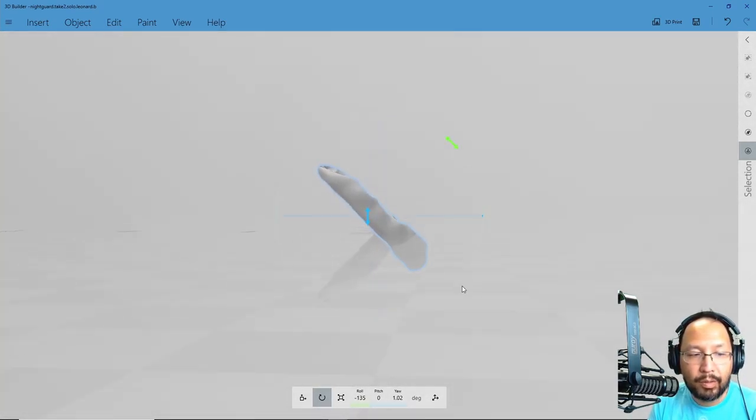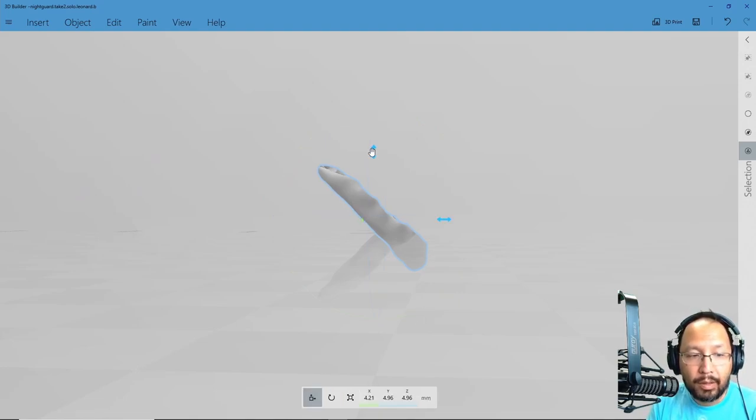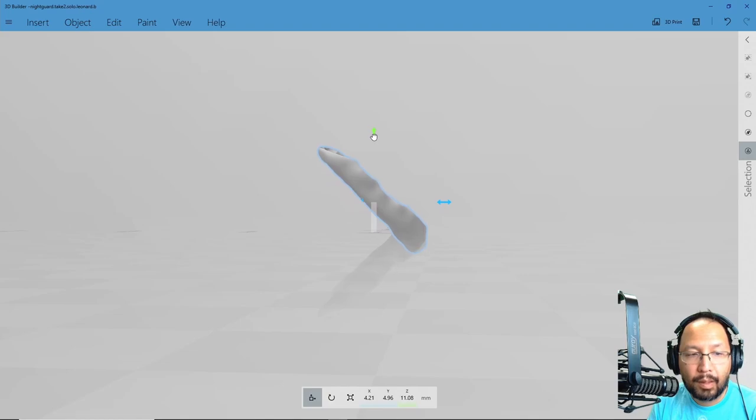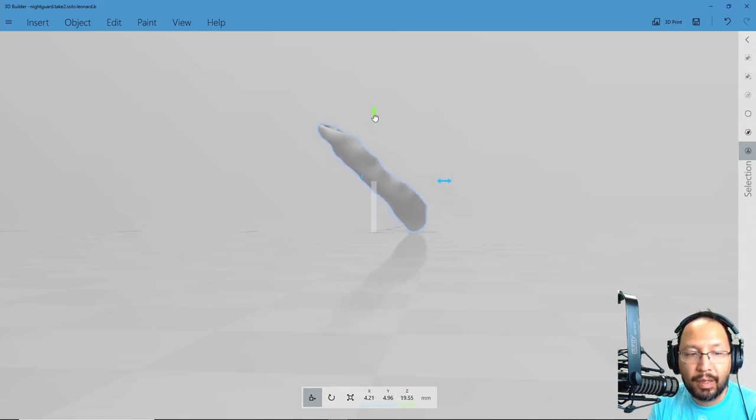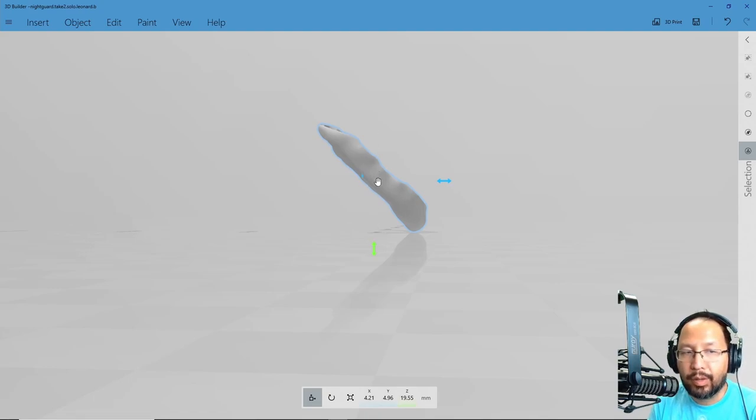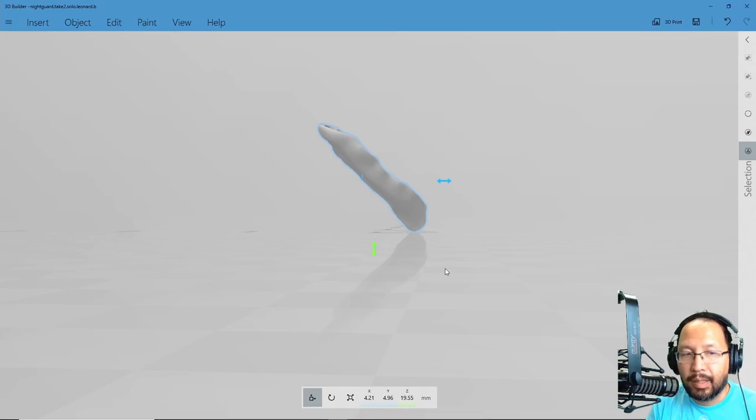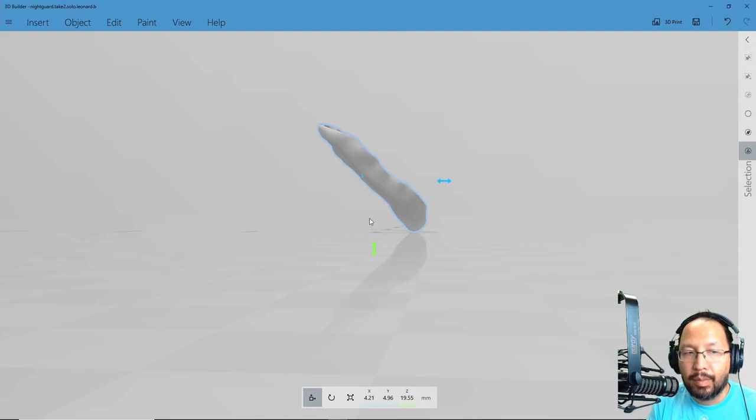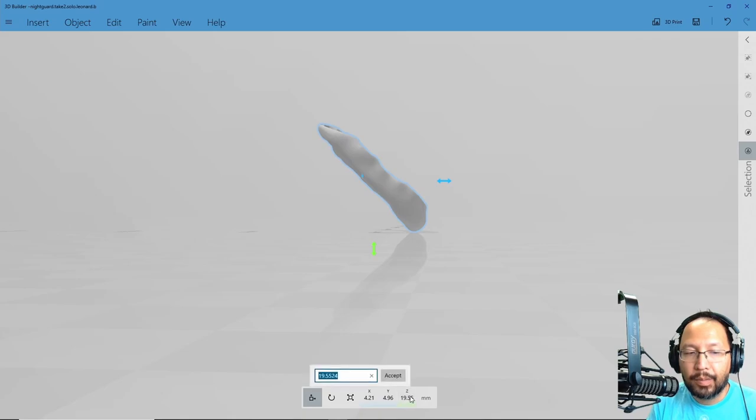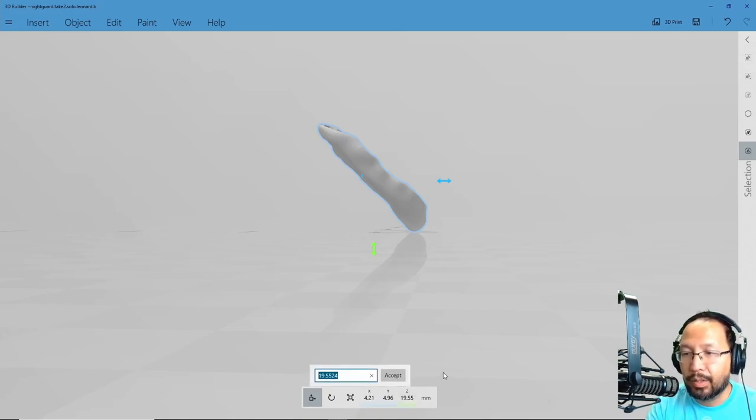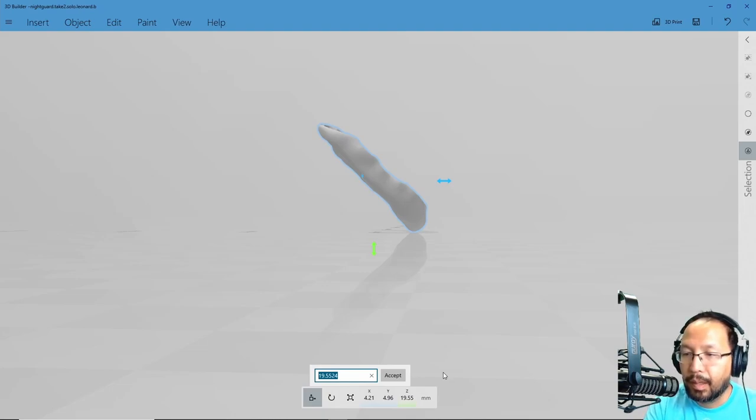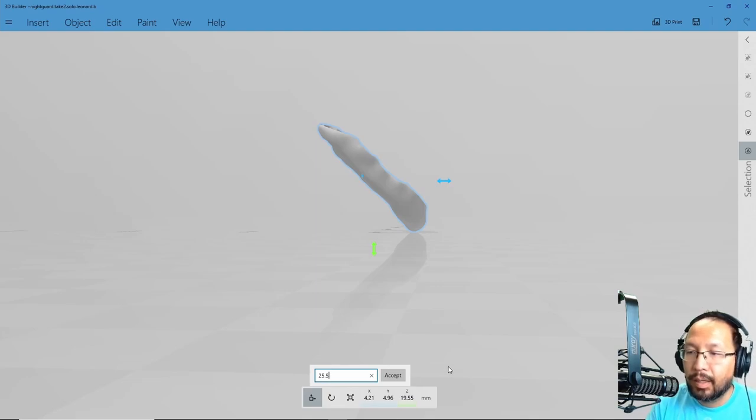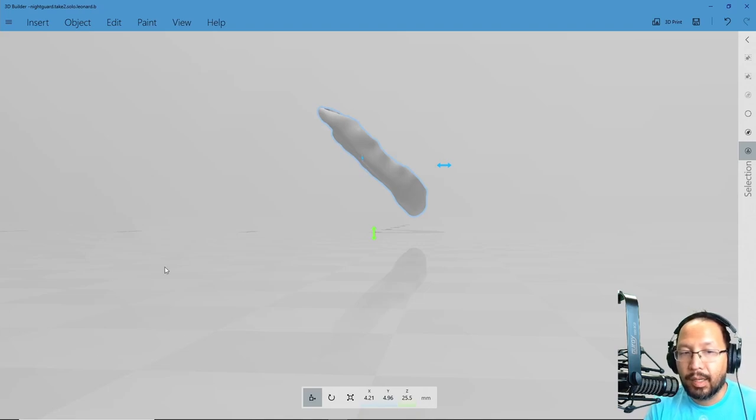And now I'm going to lift it up. Now I use this little lift key, lift arrow, and I'm going to lift it up to there, and that's 19.55. Windows 3D Builder has this weird thing where it measures the Z not by the amount from the bottom to the platform, but it's measuring it from the middle of the model to the platform. So what I need to do is add 6 millimeters to this. So 19.5, we're going to call this 25.5. That's adding 6 millimeters. I'm going to hit accept, and that's going to raise it up about 6 millimeters.